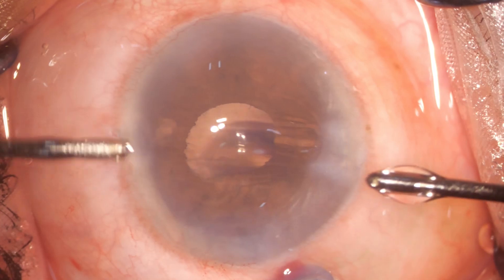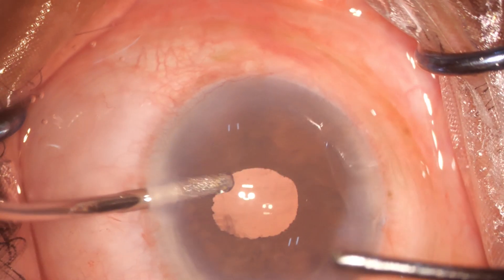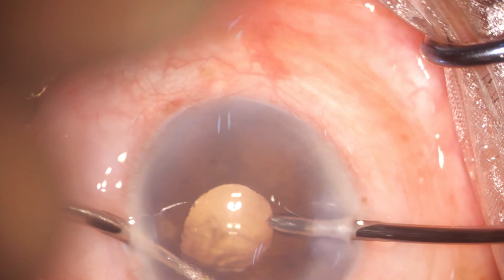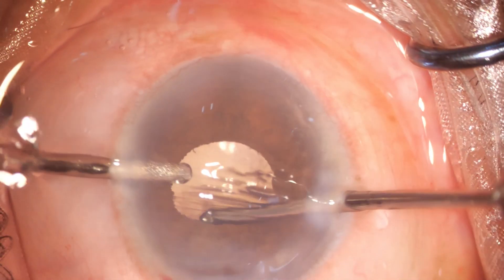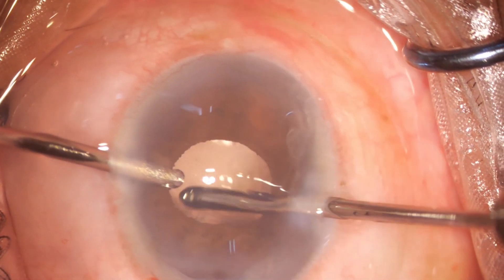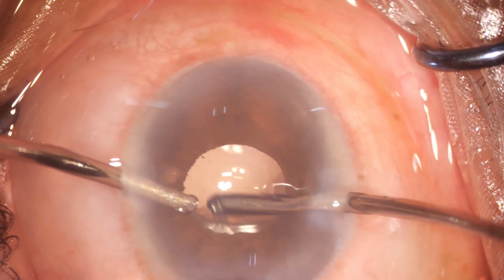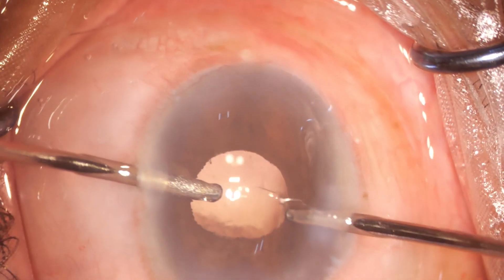Trying to hydrate the cortex so that it becomes a little more fluffy, and one is trying to see where all the cortex is present. Then trying to go around the lens in a little rotatory manner and pulling it out centripetally.